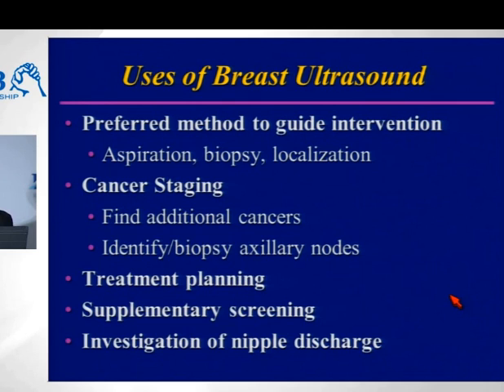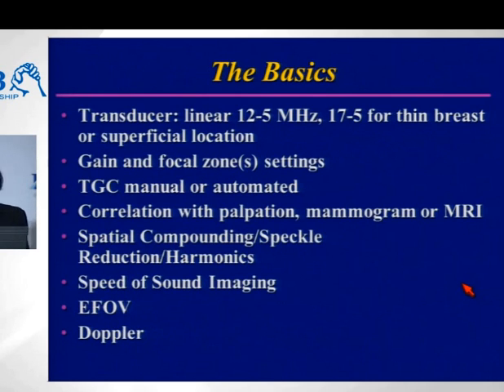We use ultrasound, of course, to help with cancer staging when we're asked to find additional cancers and to identify and biopsy axillary lymph nodes in patients with a newly diagnosed breast cancer. And in that way, we can help with treatment planning. We've started using it for supplementary screening and for investigation of nipple discharge. So ultrasound's a really important tool.